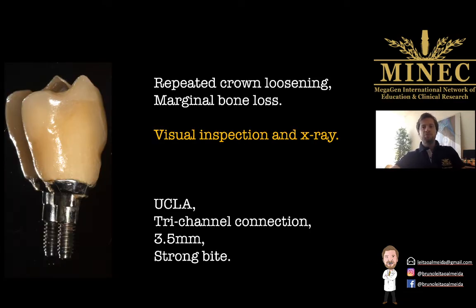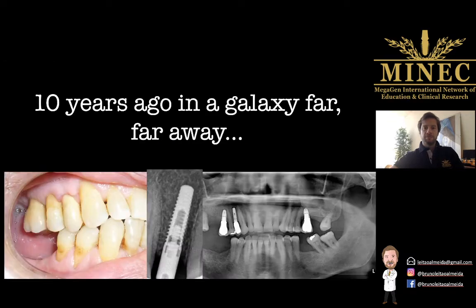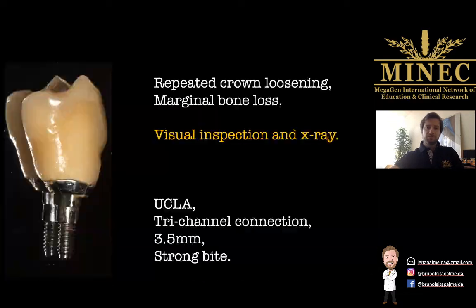So this patient came to me with repeated crown loosening and marginal bone loss. When we removed the crown on the upper premolar that you can see here in the picture, it was quite clear that there was a fracture on the platform. Using visual inspection, you don't need to have loupes or anything. You can see it from a mile away. And of course with the x-ray that I'll show you a little bit later.